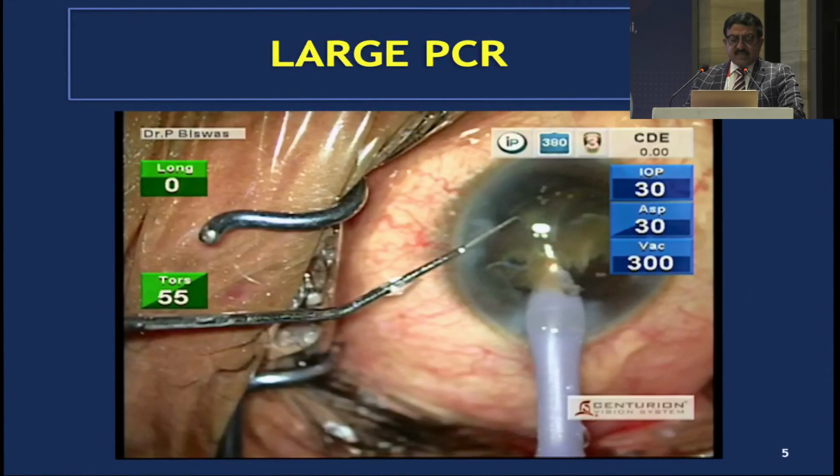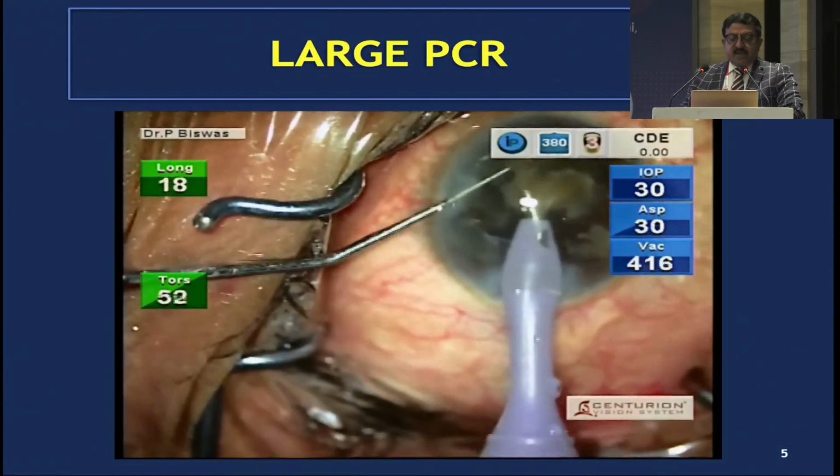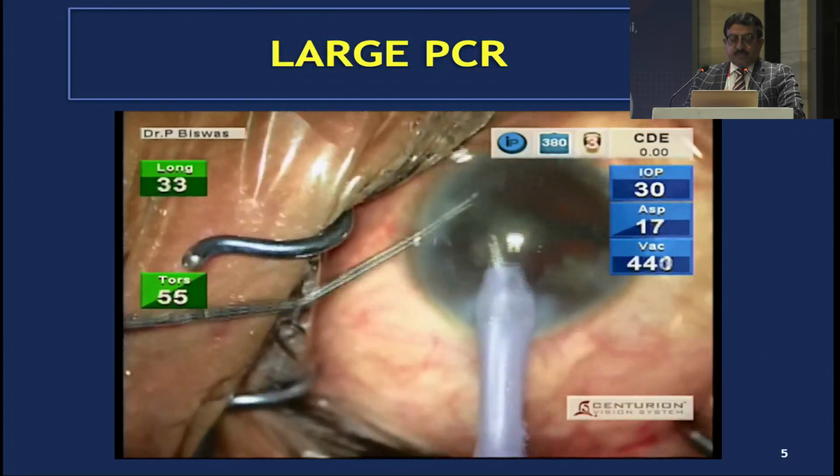Now again, this is a large PCR, and with this large PCR, if the nucleus can be removed, it's important to remove as much as possible.